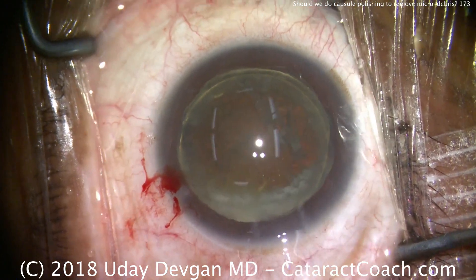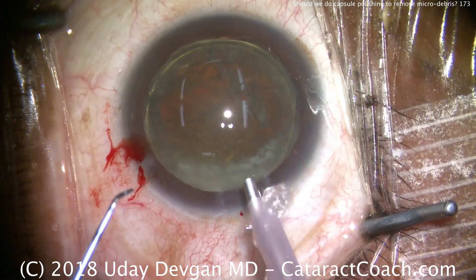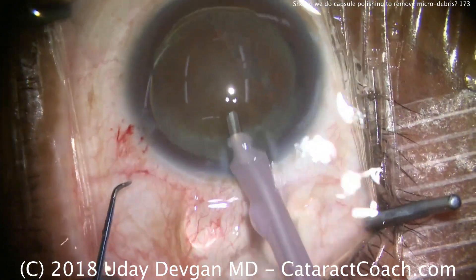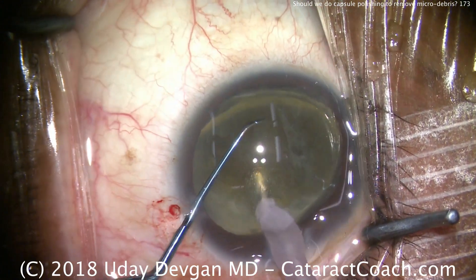Now a little more viscoelastic to coat the endothelium — that's a dispersive, of course. And now we're going to put the phacoprobe in the eye and put our chopper in here as well. I'm going to buzz into the nucleus.